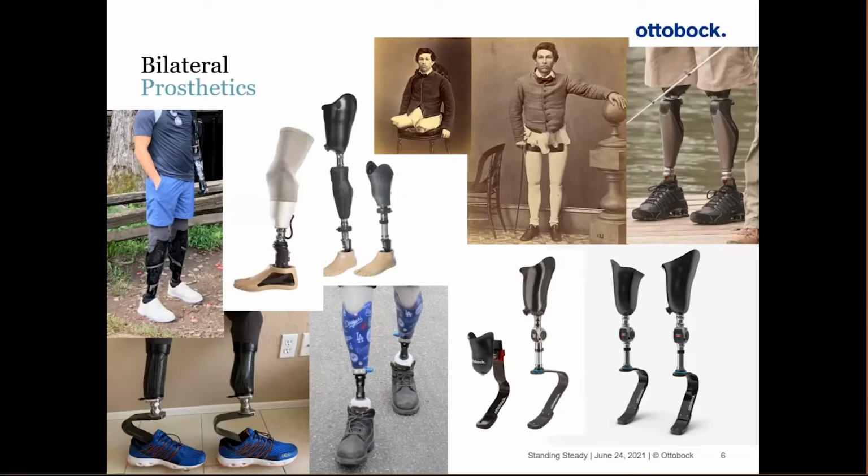He is currently wearing Taleo feet, which are Ottobock carbon fiber feet with the super flexible inner sockets, custom liners, and passive suction with sleeve suspension. He also has a running setup on the bottom left with completely different sockets, and these are Challenger feet. So he's running about a 5K, and he was training for a half marathon, and he uses a completely different setup. So this might be possible and may not be possible for everyone, but it's pretty important to be able to consider what the user needs in the whole spectrum.